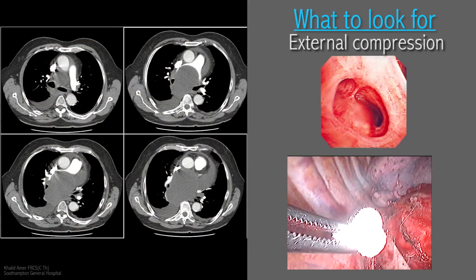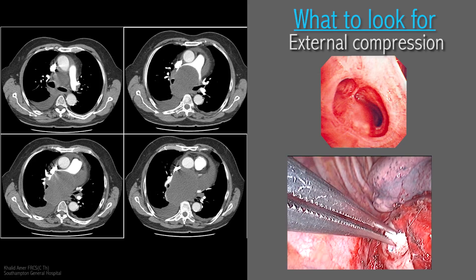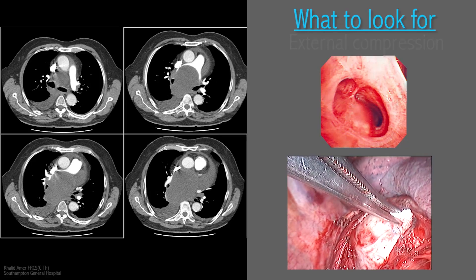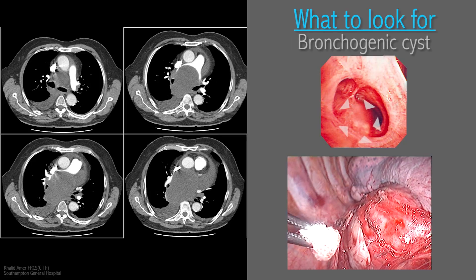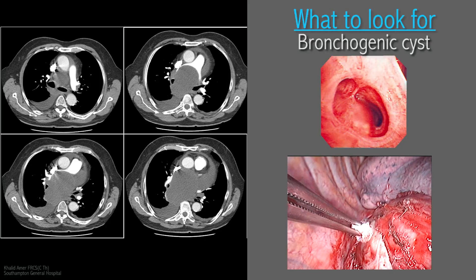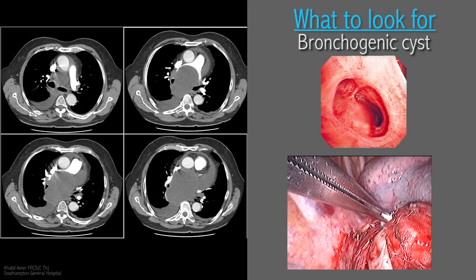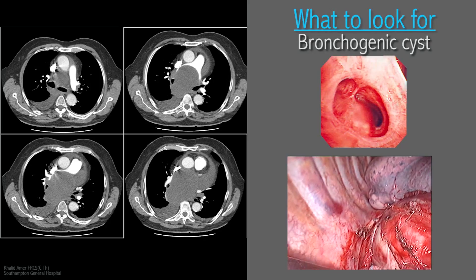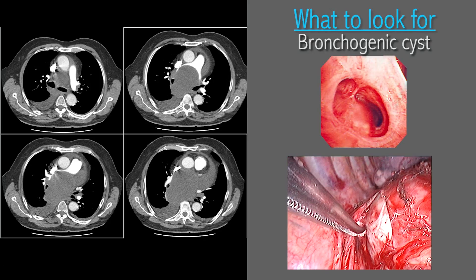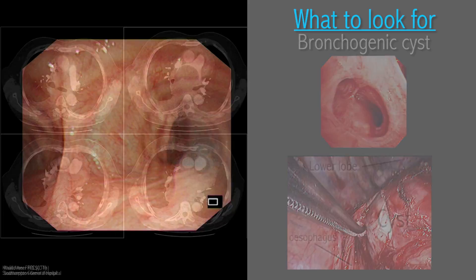Before leaving the area of the carina, here is an example of external compression. The subtle asymmetrical rise in the membranous part at the take-off of the right main bronchus is abnormal. It transpired that it was caused by a bronchogenic cyst expanding the subcarinal space.